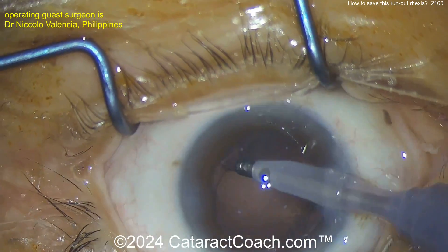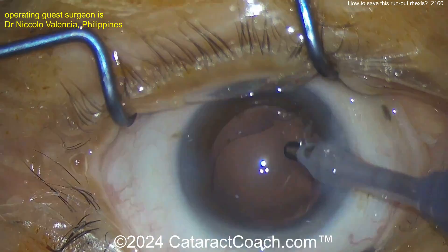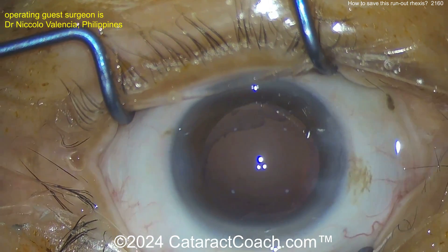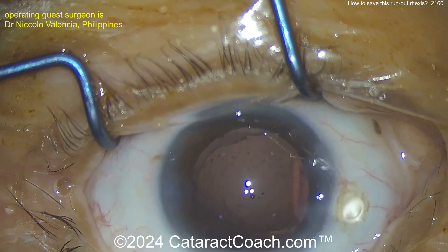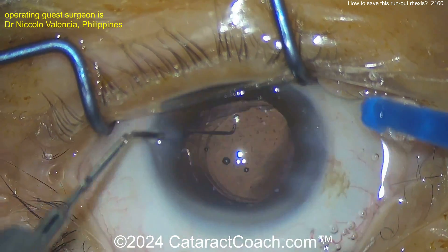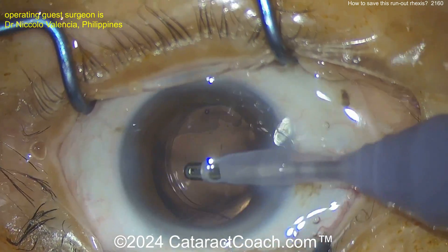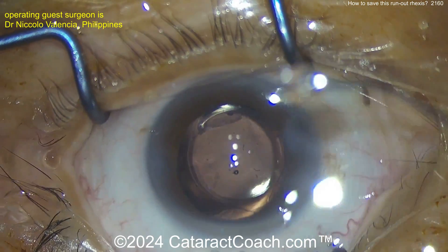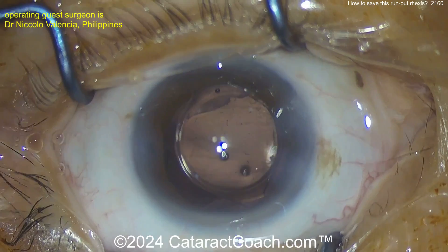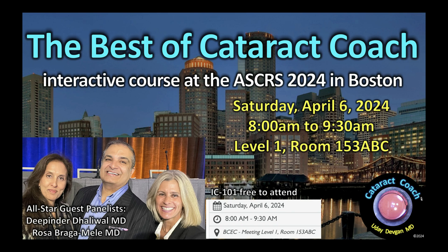The radialized areas are at roughly two o'clock and eight o'clock. Get the cortex out nice and easy, be careful at those ends. I wouldn't do too much capsule polishing here — just call it a day, get the lens in the bag, and go home. The patient's going to be thrilled. White cataracts are our favorite because patients go from truly blind — hand motion or light perception — to normal vision. There's the lens in the bag, beautifully done. Clean up the viscoelastic, seal up the incisions — don't be too much of a perfectionist. Beautiful outcome. Thank you for sharing it.